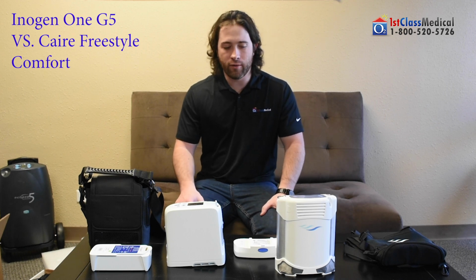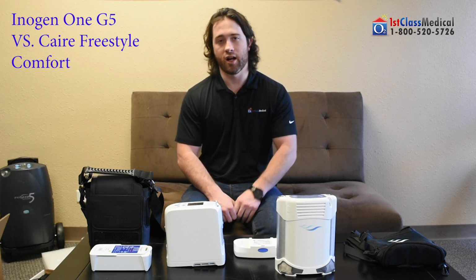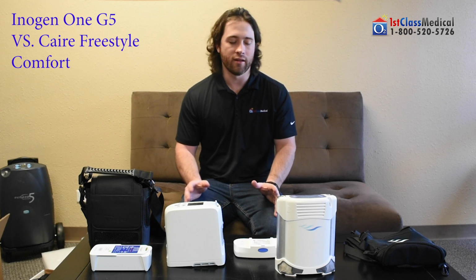But at the end of the day, we want to make sure here at First Class Medical that we are guiding you to the best portable oxygen concentrator for your needs, because everybody's needs are different.